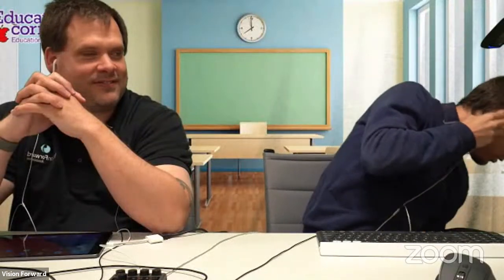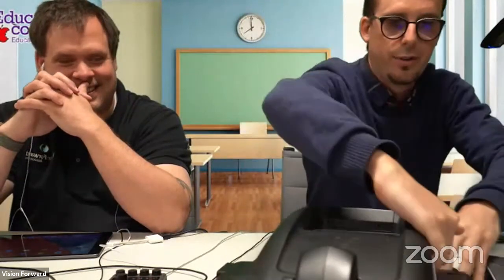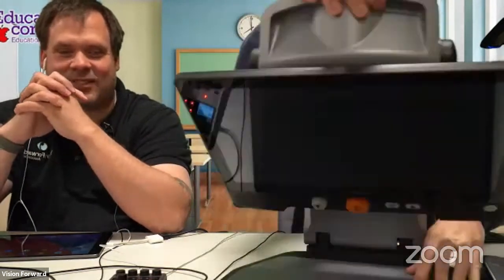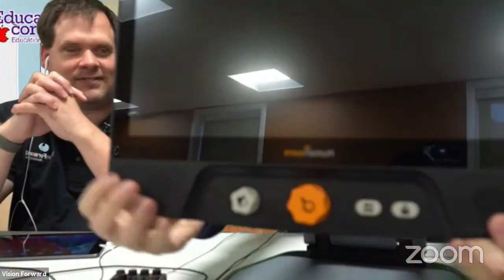Allow me to get that from here. This is where things are going to get very interesting. Nothing can go wrong here. Okay, so we're going to have to switch cameras again. Okay, so this is where things are going to get very interesting. Oh, one-handed. Here we go. Okay. Oh, wow, that was intense. Almost had to file workman's comp there for a moment. Seriously. Okay, so here we are.